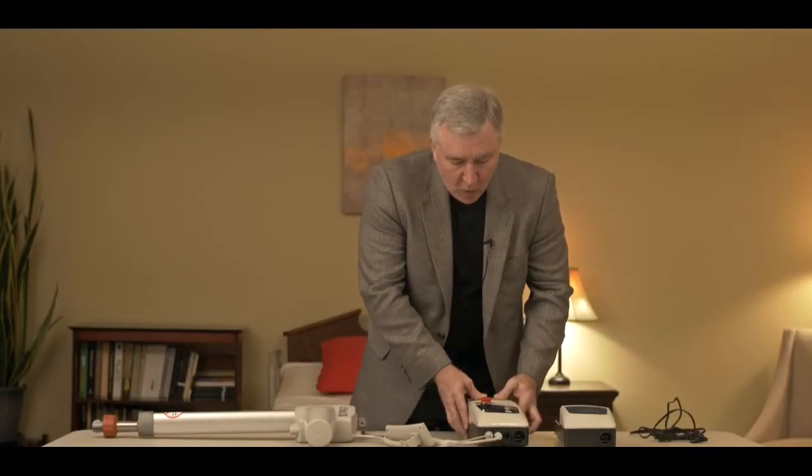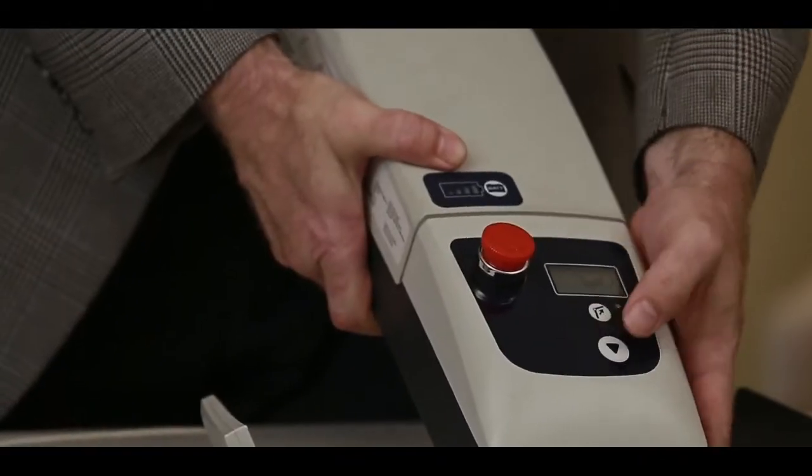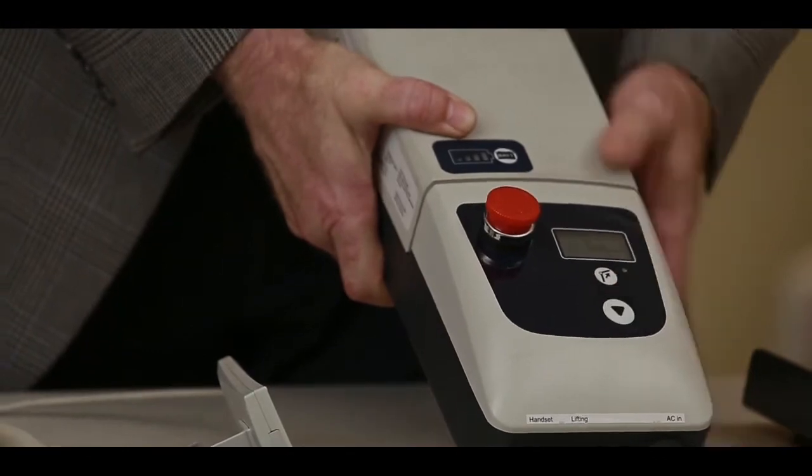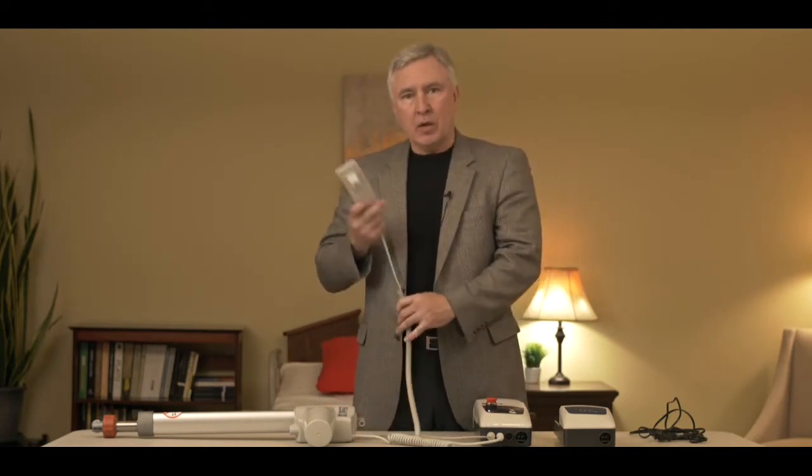So what happens if all that is connected and we go to run the lift with the hand control and it still doesn't go up and down? At that point I would advise that we go to the auxiliary switches that are on the control box to see if those run the lift up and down. If they do, then you got a bad hand control. Hand controls are probably the second main reason the lifts fail, because they do get dropped and the cords get broken.